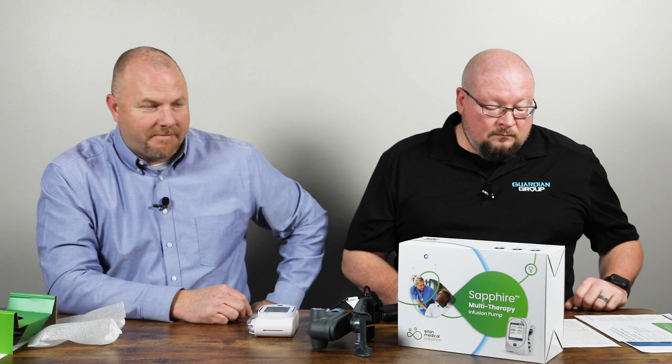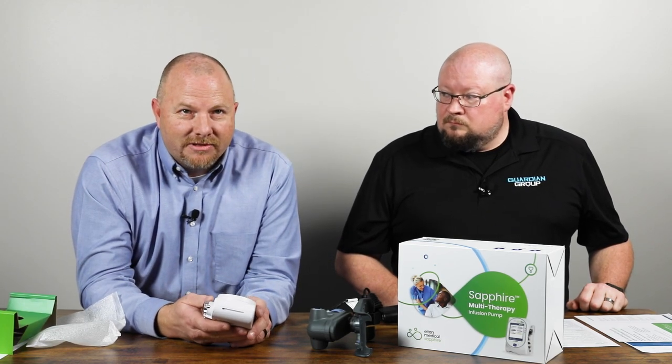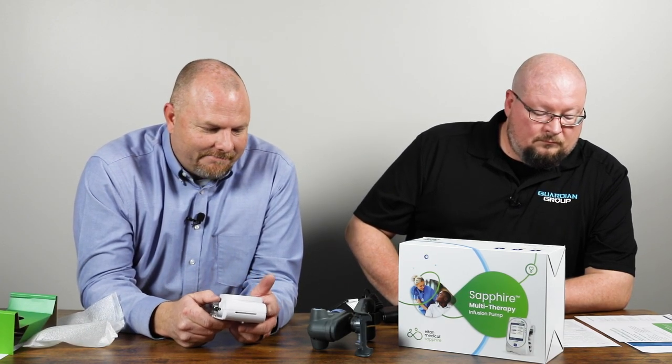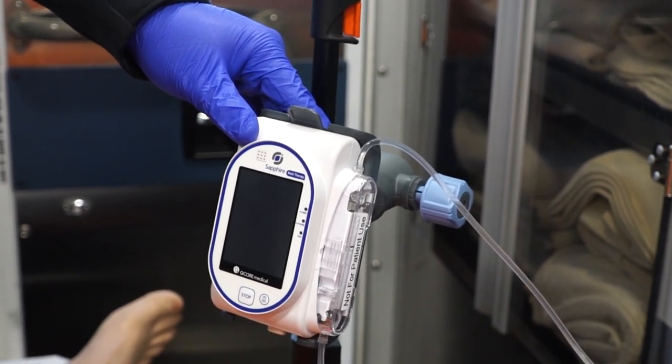Speaking of the warranty, it comes with a two-year manufacturer warranty. We have sold a few thousand of these pumps over the last couple of years since I've been with Master Medical, and I have personally not had the first complaint. Everybody that gets this pump says, look, it just works. And that's what we need in the pre-hospital environment, in the emergency setting — we need something to work. We don't need to be fooling with air in the line or alarms that won't clear. The Sapphire just works, and that's what we want to sell.